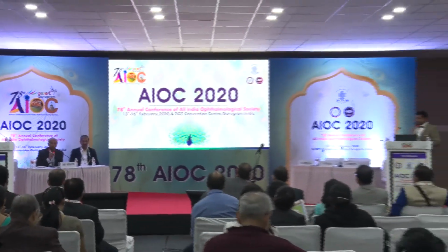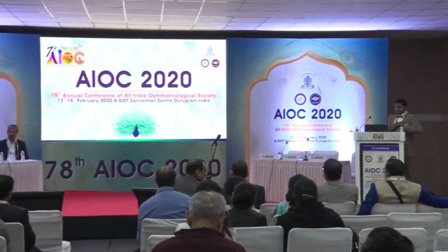Thank you, Nishanth. Any questions from the audience on the topography for biometry? If not, I'll just make one observation. Both the previous speaker and Nishanth just made a passing mention about the corneal refractive index being one source of error. Because every keratometer assumes the corneal refractive index to be something.